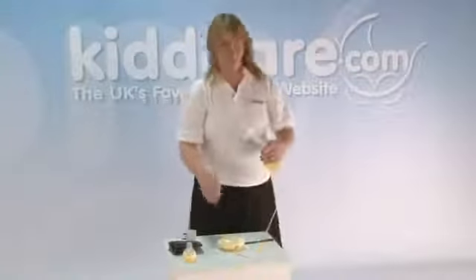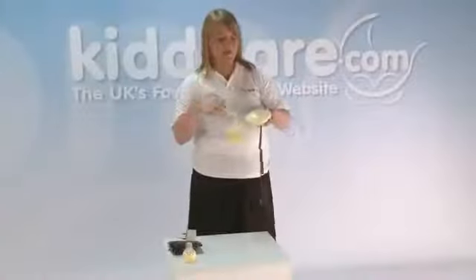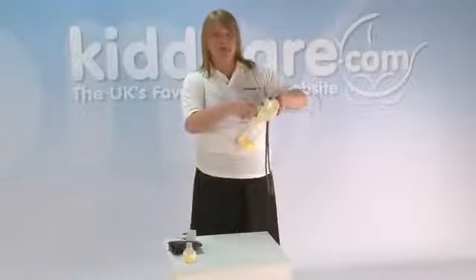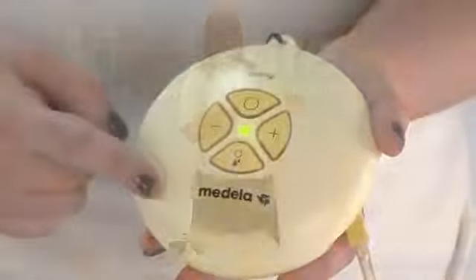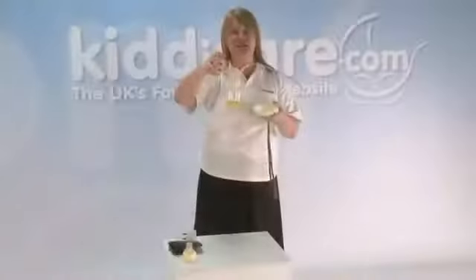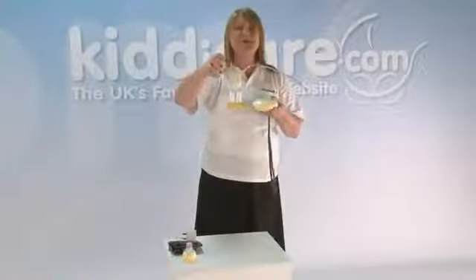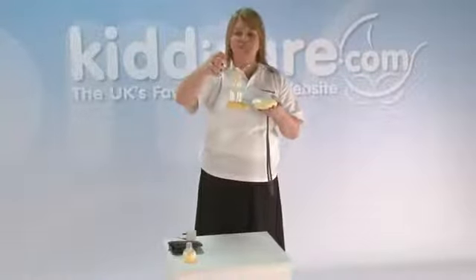So with the Swing, what we need to do is to ensure that mum positions herself with the nipple as centrally as possible here in the breast shield. So to turn it on, you press the button at the top here, that's the on and off. So if I press that now, you'll see that the green light starts to flash. And if we look, the pump is doing rapid sucks. We call this the stimulation phase, and that's the first part of our two-phase expression. If we think about the baby, they're those little rapid sucks before the milk starts to flow.